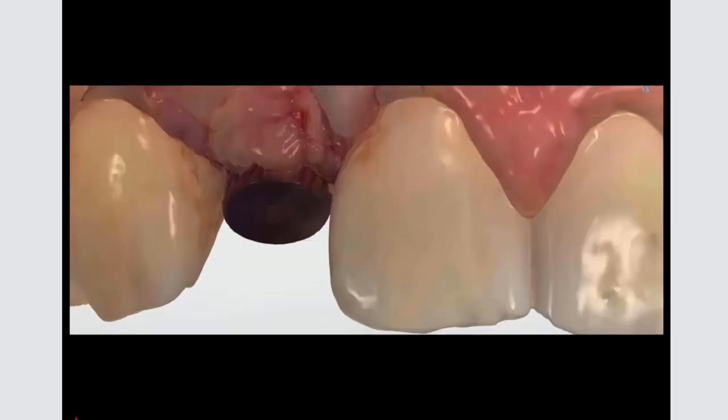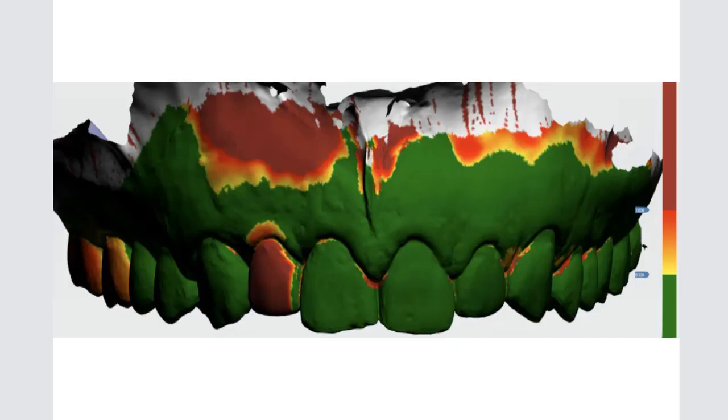This gives us a lot of information and also a lot of potential for research, potential for understanding all the techniques we are using for grafting tissue, for grafting biomaterials, as you're going to appreciate on the next slides that are coming up. Here is one of the slides. Here is again the 6 scans overlaid. When you see that, the color bar gives you the thickness or the amount that was changed.